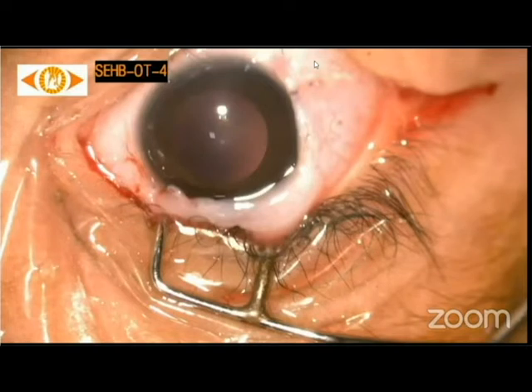For instance, in this child, inferiorly there is no posterior vitreous detachment, while superiorly posterior vitreous detachment was there. So we relieved the relevant traction, and the avascular retina was treated with laser photocoagulation.